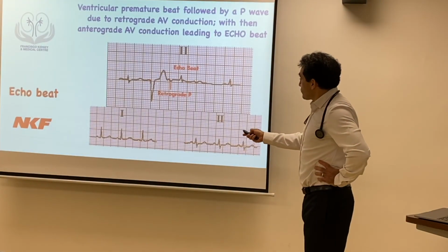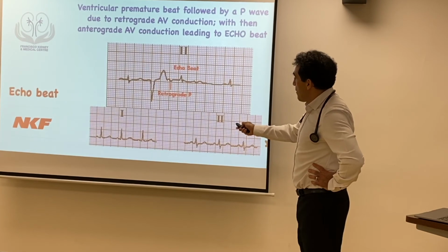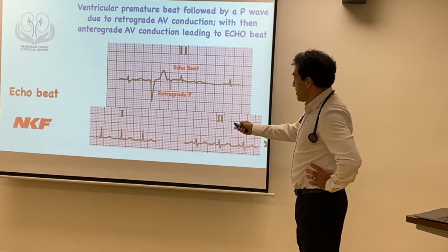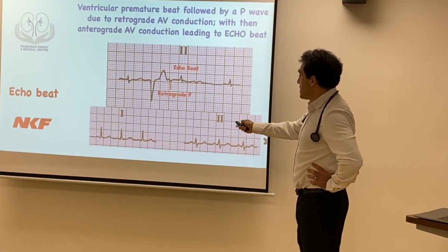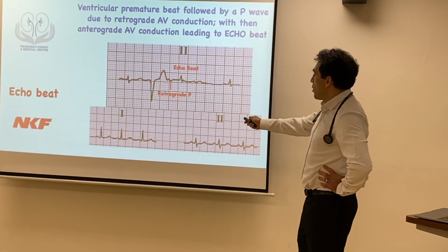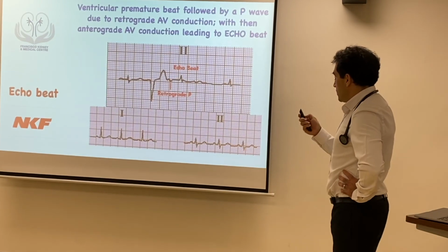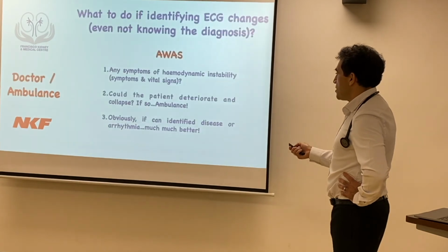So, oops, always press that. So, ventricular contraction retrogradely activates the atrium. Is the same firing. The atrium contracts, and the atrium creates this complex that is also different from this one. Yeah. So that's the echo beat. Just by collateral activation, sort of. But I just put that because it's quite interesting.